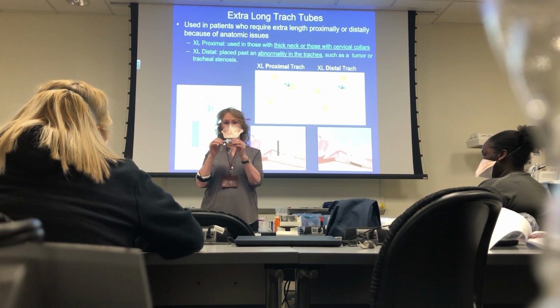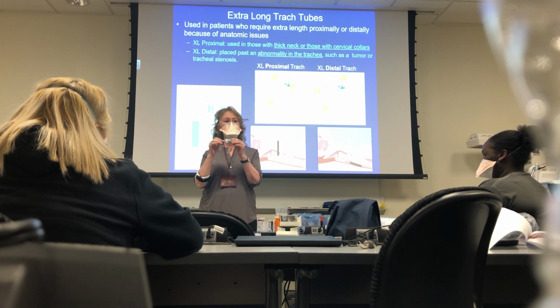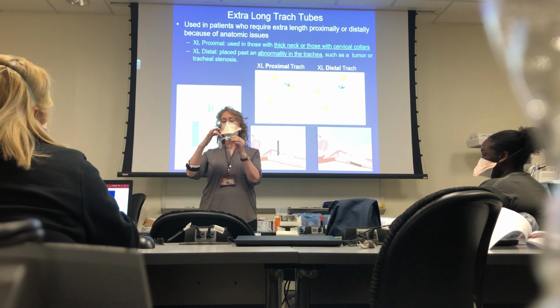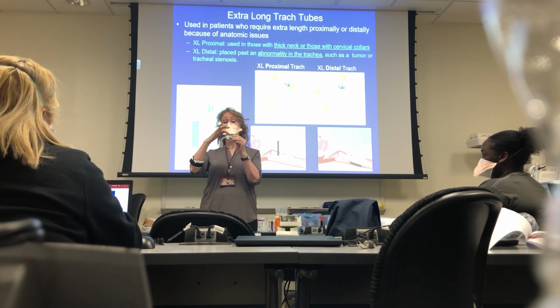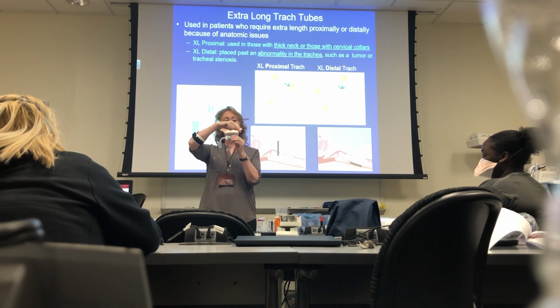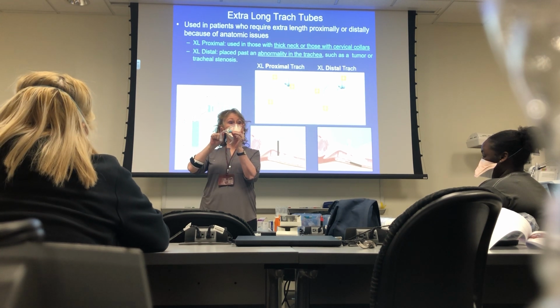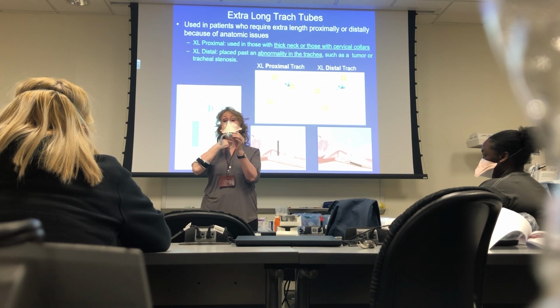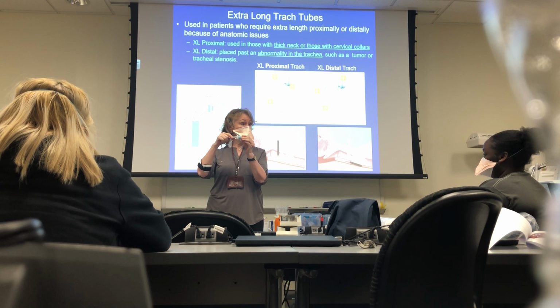Proximal. Got it? Did everybody get to see that? From here to here, on this one is normal size. See that? So that will go through. If somebody has a very fat or bull neck, the curvature does not happen when it's close to the adipose tissue, because those trachs can dislodge.